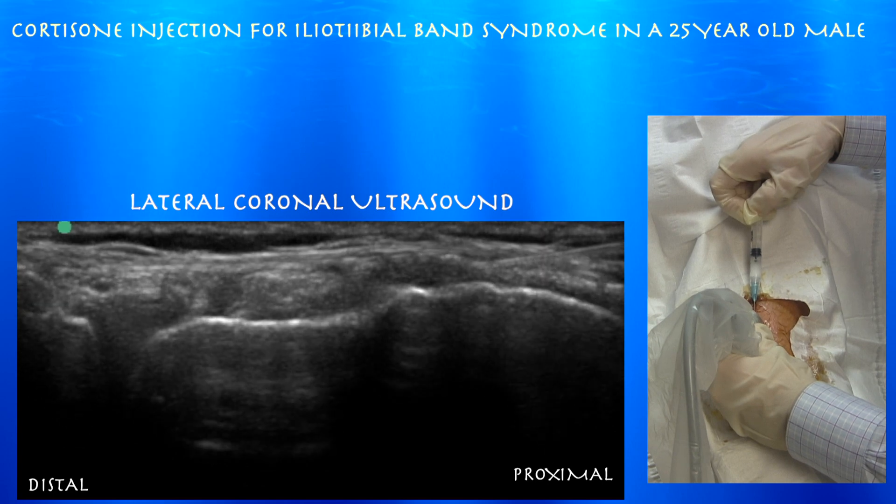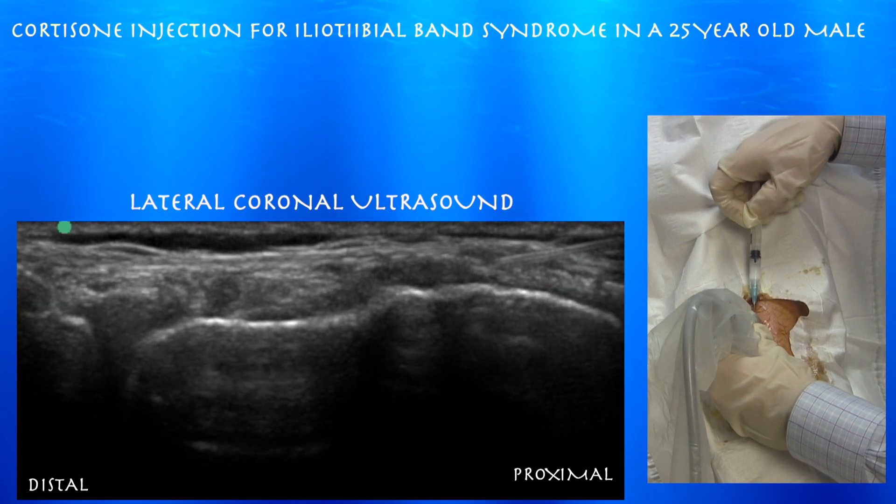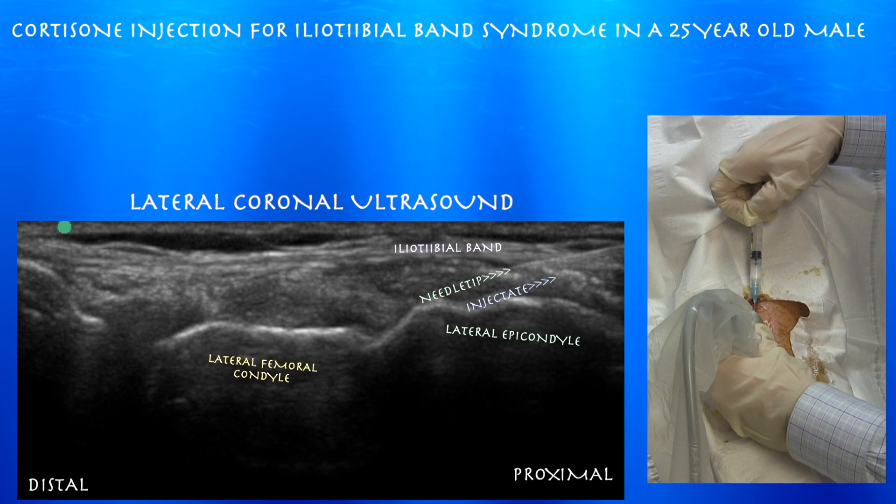Here you can see we're just finishing up the injection, and you can see that iliotibial band moving upward from the pressure of the injection.